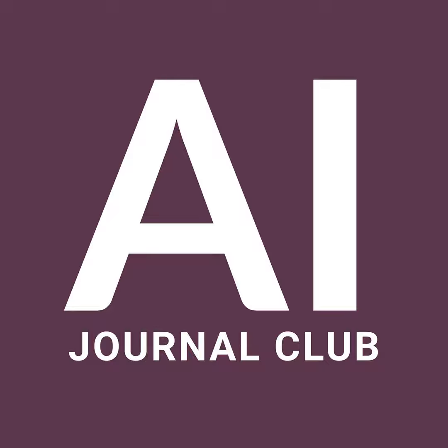That's the one, the dual assessment. For 1 to 3 months, you diagnose live cases, but you have to do it digital first. What does that mean, digital first? You have to look at the screen, make your diagnosis, and write it down. Only then are you allowed to pick up the glass slide to verify. Ah, I see. So you can't be biased by looking at the glass first. Exactly. You have to prove you can reach the right conclusion with the screen alone, without the crutch of the microscope.